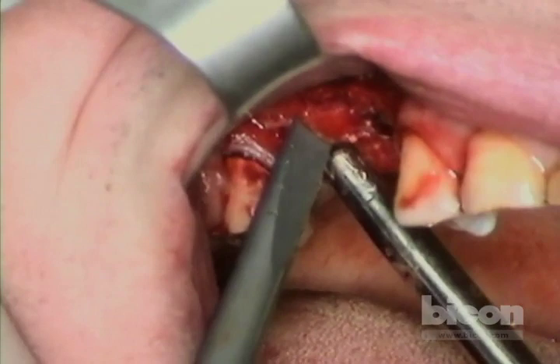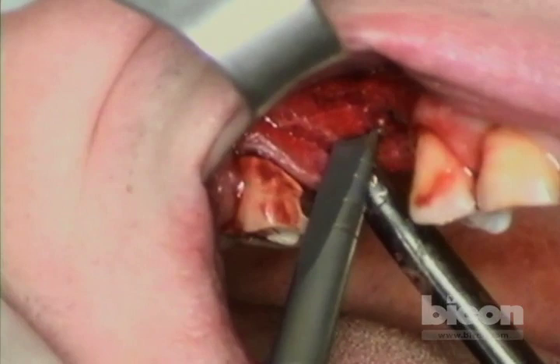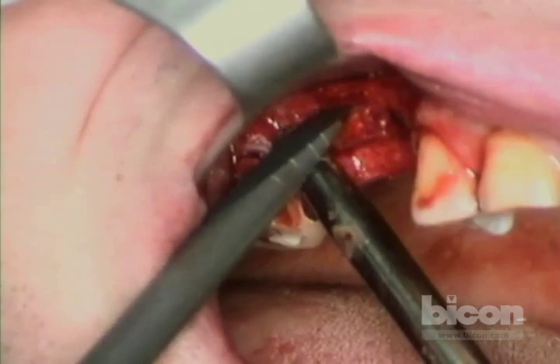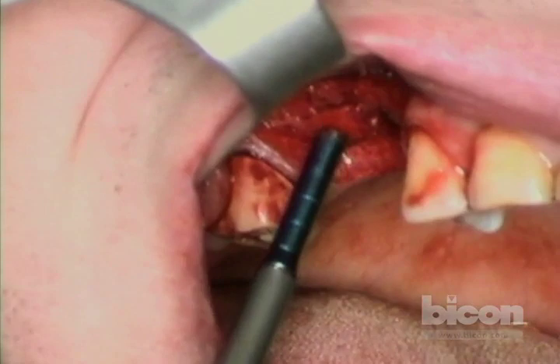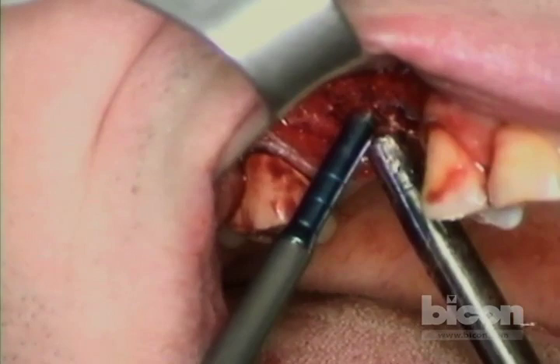We go back and re-freshen our cuts. It's starting to mobilize in the posterior edge, so I need to freshen up the anterior cut.